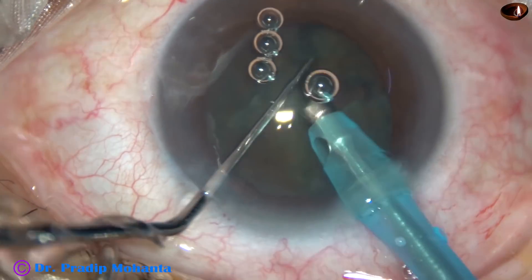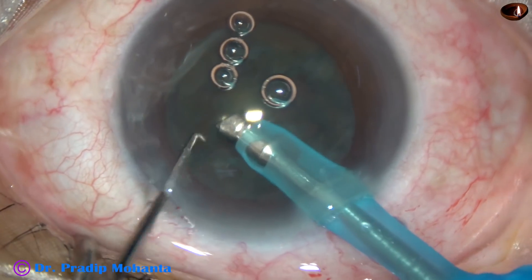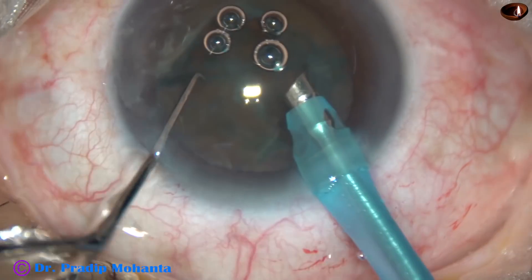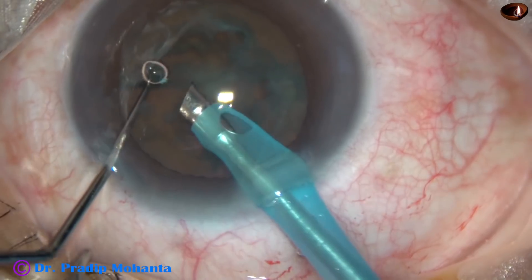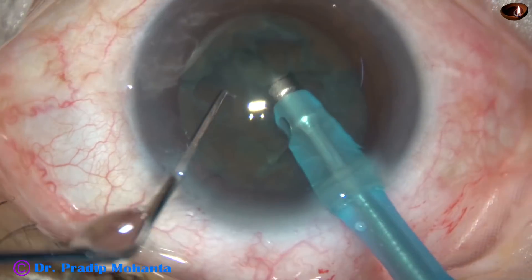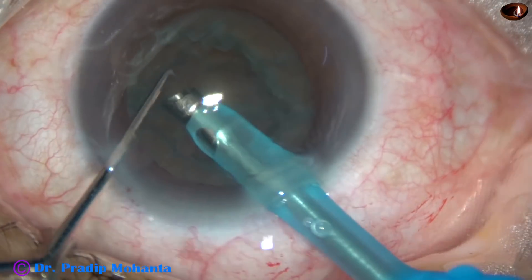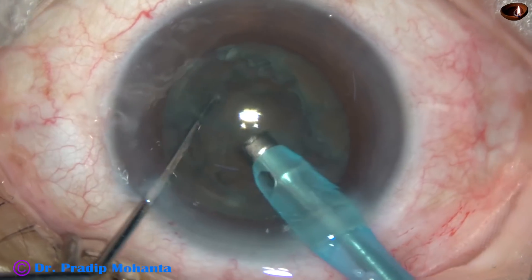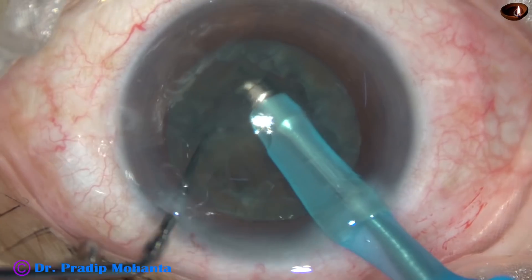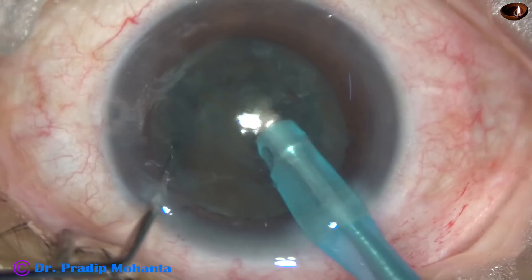It has been a very good crack, but I could not separate the lens mass into two halves. I tried to hold it here and there, and thus it has become a bowl. A central bowl with a very soft cataract is a very tricky situation.